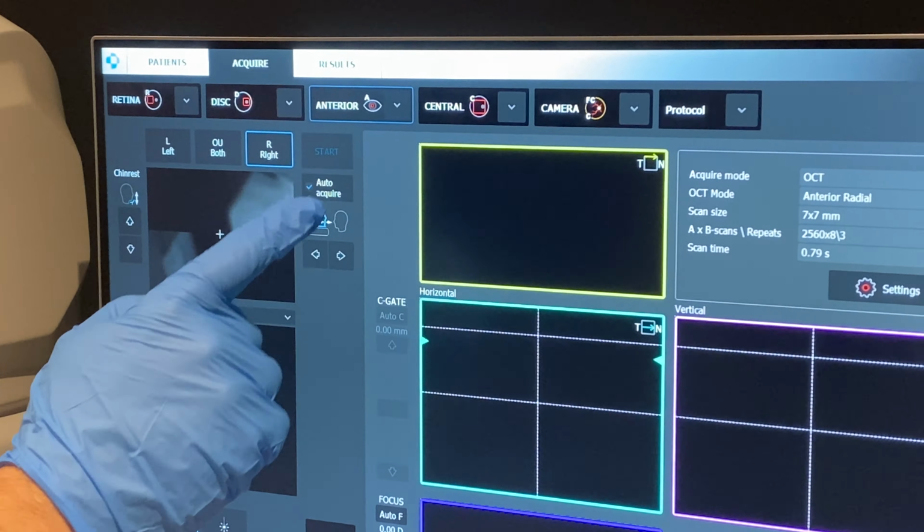The other thing you can do with output is if I press output top right again, instead of a PDF, you could do tomogram series. Because a PDF is obviously just a two-dimensional image. So I highlight tomogram and then I click OK. This is going to take longer to save because it's a bigger file size. Then I minimise the software again, open the output folder, open today's date. Now I've got a folder. Oops, let me go back one. So I've now got a folder of Steve Edwards, drag that to the desktop.